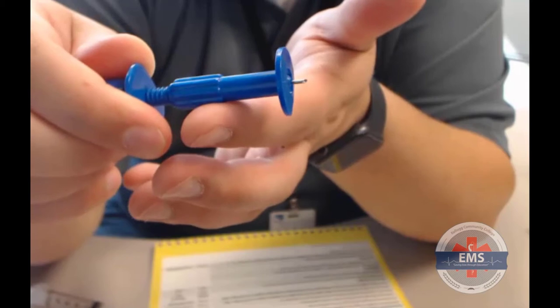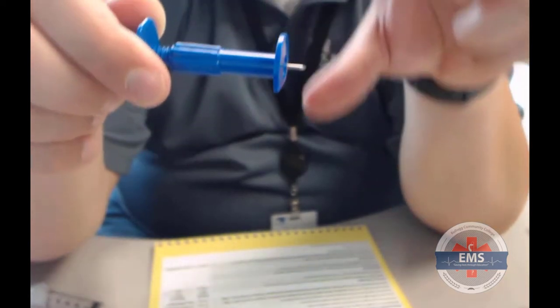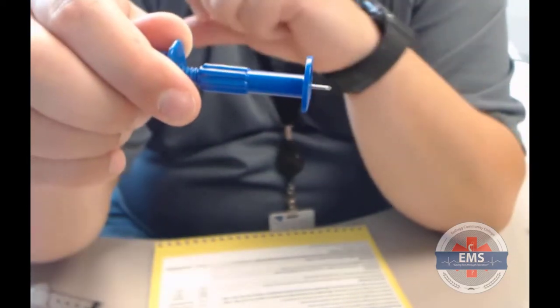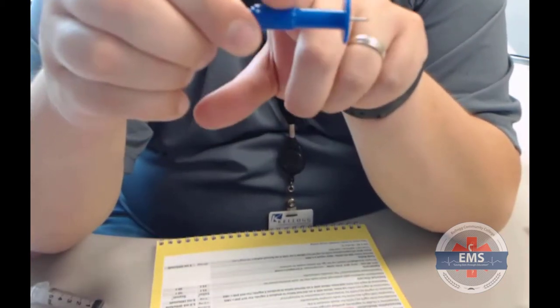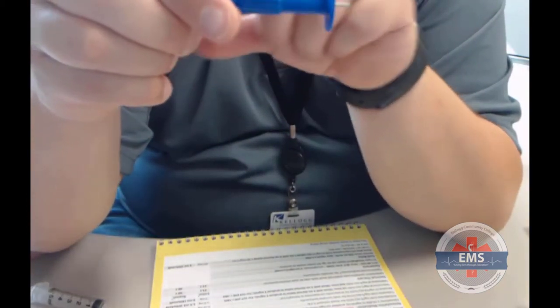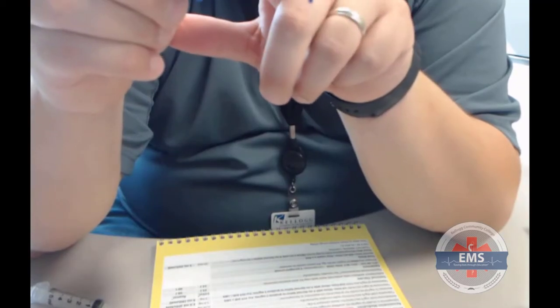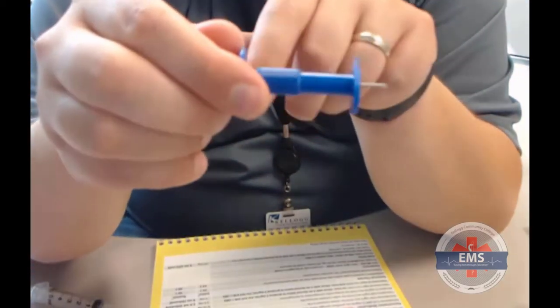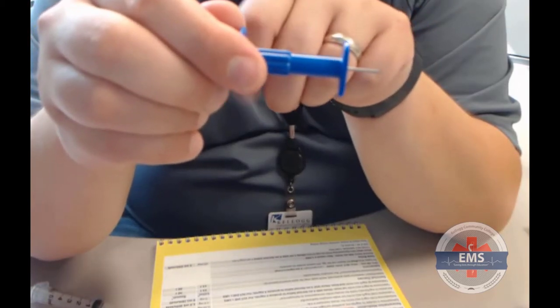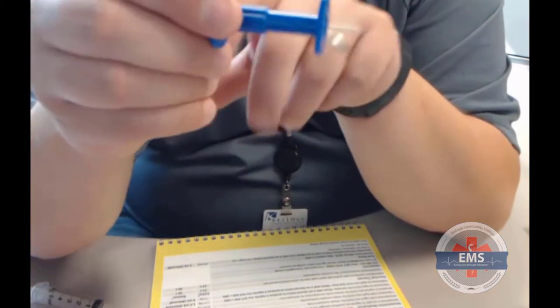The other thing I can do is pre-measure. If I've got a really small kid, I don't want my needle exposed more than half the distance of the thickness of their leg if we're using the tibial tuberosity. So I can adjust that down or make it longer if I need to. That's a really important tool, especially when it comes to stabilizing after you've placed it, or again, preventing you from going through the bone canal itself, past the bone marrow and into the posterior side of the calcified bone.